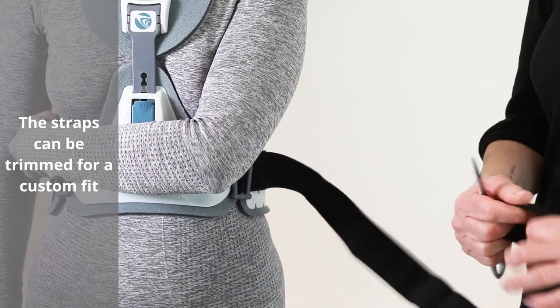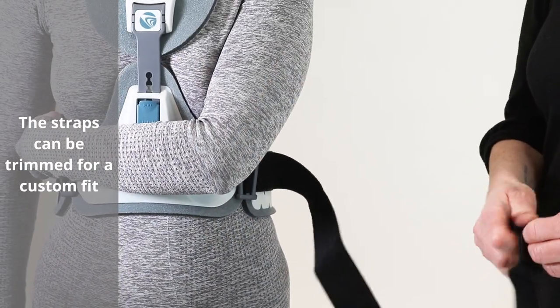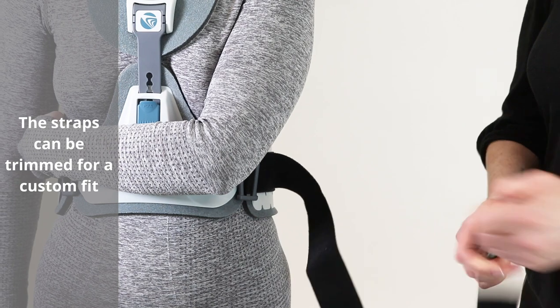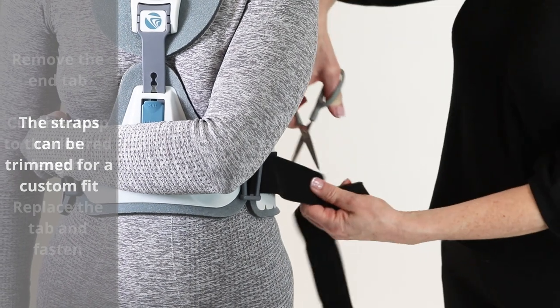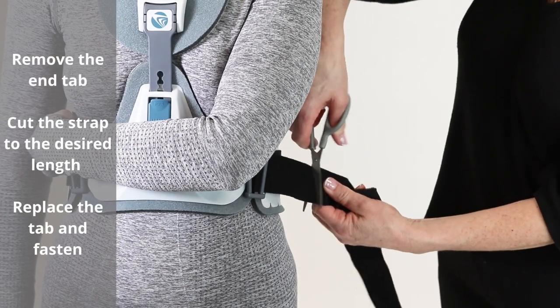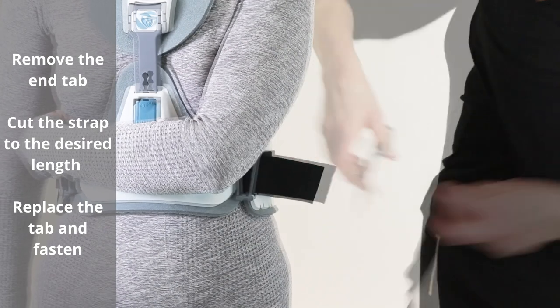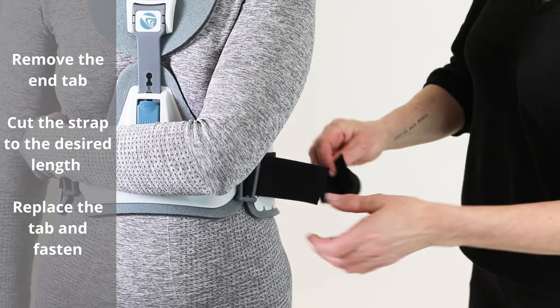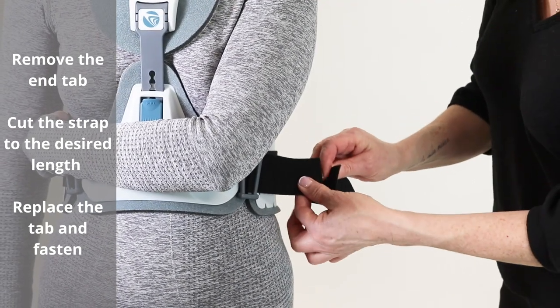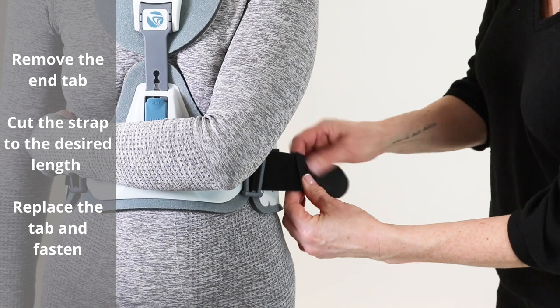The straps can be trimmed for a custom fit. Remove the end tab, cut the strap to the desired length, then replace the tab and fasten.